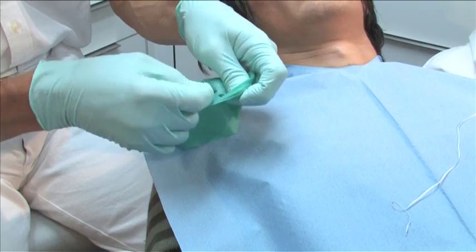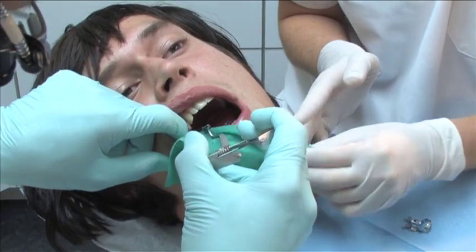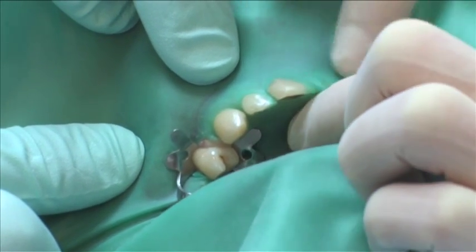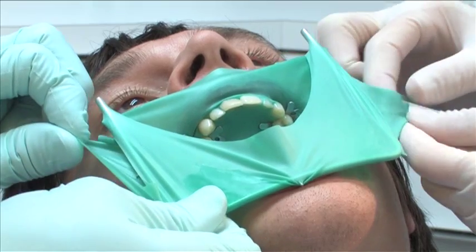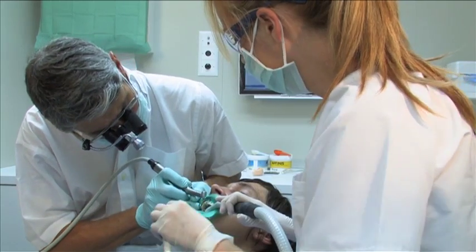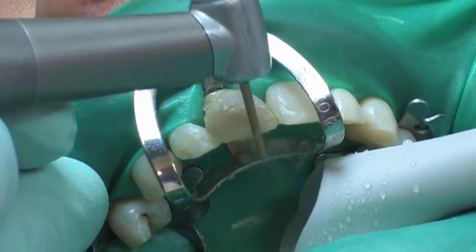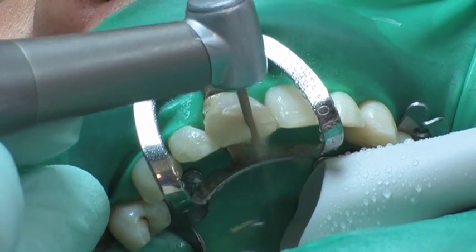A latex rubber dam is applied over the adjacent teeth to maintain a dry working field. The old, non-aesthetic restoration is removed completely using a 125 micrometer diamond instrument until the pulp chamber is exposed.